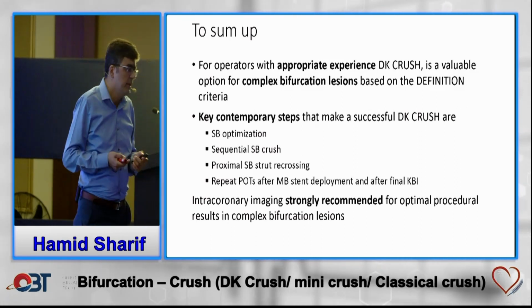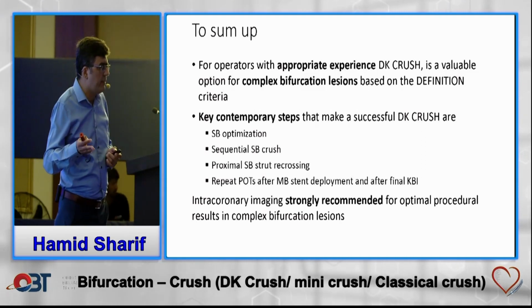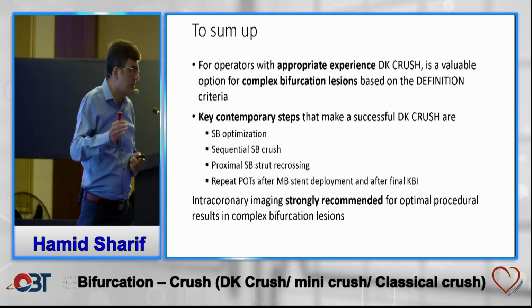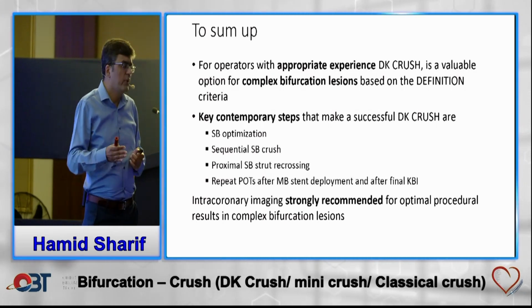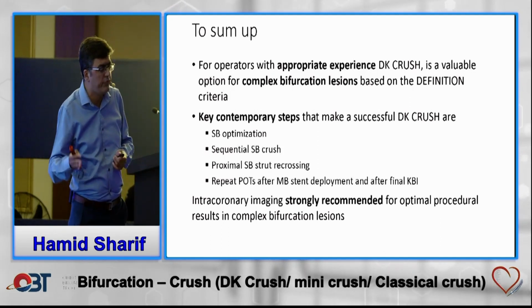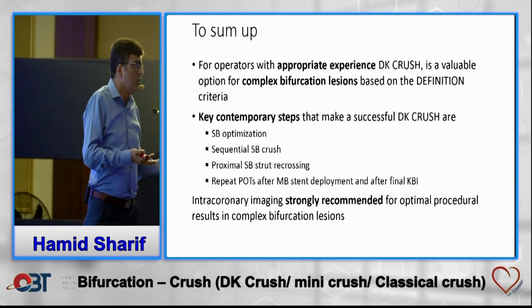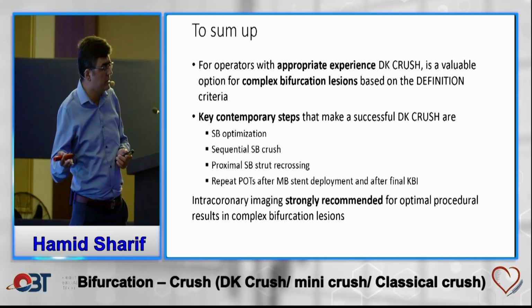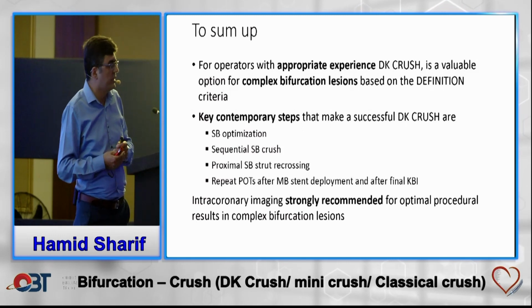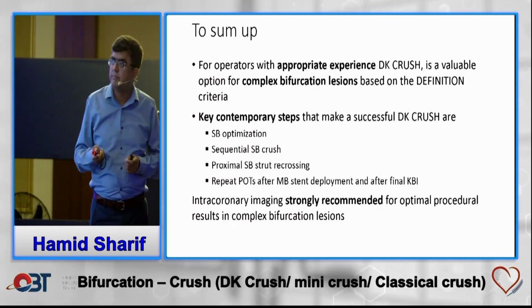For operators with appropriate experience, DK crush is a valuable option for complex bifurcation lesions based on the definition criteria. Knowing the basic steps and performing DK crush properly has a lot of importance because it has very robust data behind it. If you look at the DK crush trials, from 1 till 8, the DEFINITION trials have all shown the superiority of DK crush, not only against the provisional strategy, but against other two-stent strategies as well, like culotte or TAP for that matter.